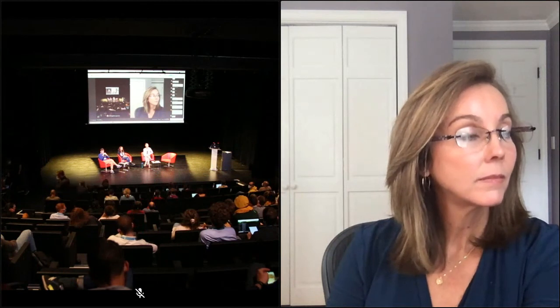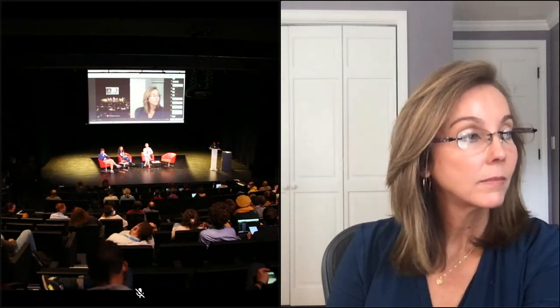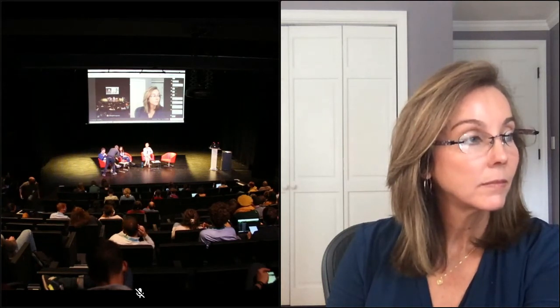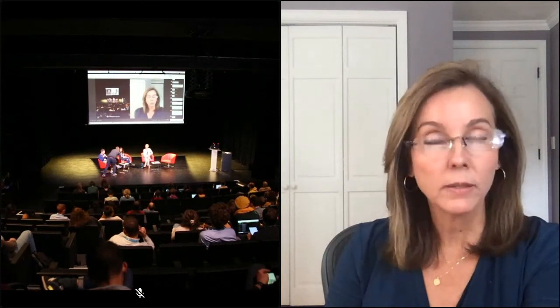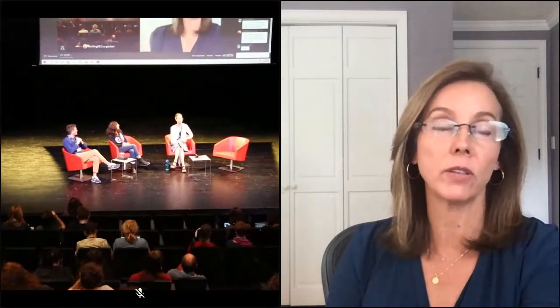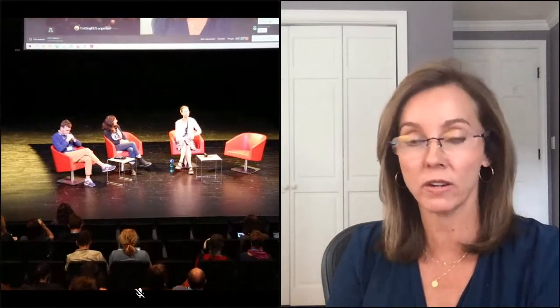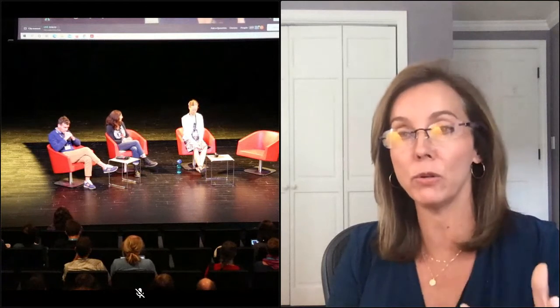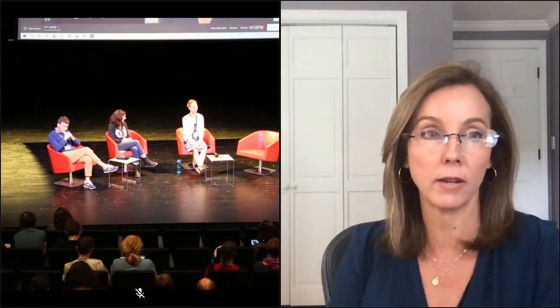So now my question is, how precisely can you reconstruct the electrical field at the other sensors that you do not directly model? Have you ever looked at that? So we're not modeling sensor level data. We are modeling what, once you've already source localized your data, so you've already taken into account the mixing of signals and how they contribute to different sensor level signals. And so we're relying on the assumption that you have a good source localization technique, and you really have isolated the contribution from an area, a patch of cortex within the brain.